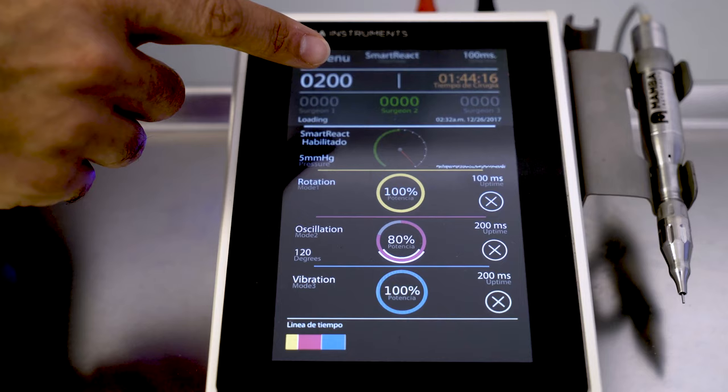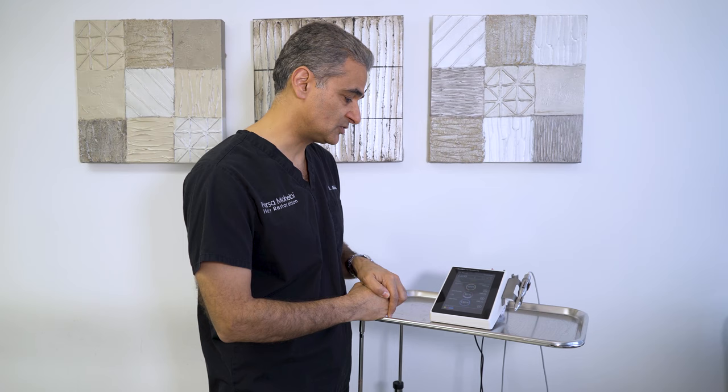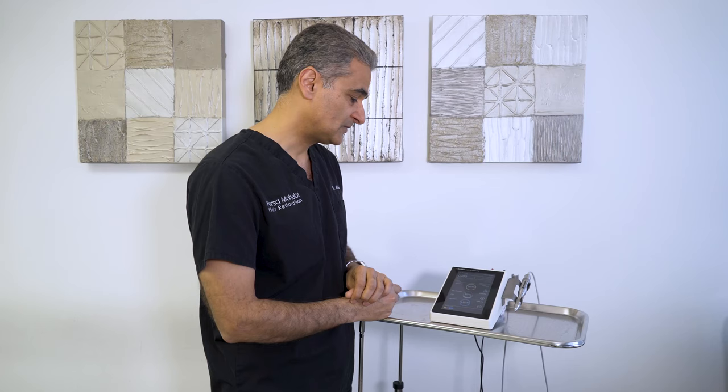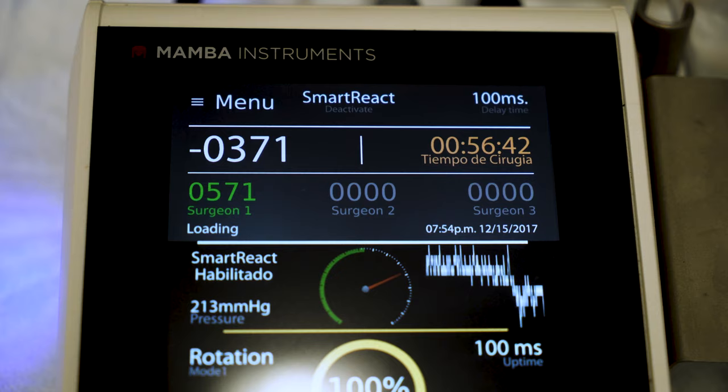You have the time of the procedure shown — how much time has elapsed since you started. You also have the number of graft attempts or harvests displayed, in addition to everything else being monitored on screen.